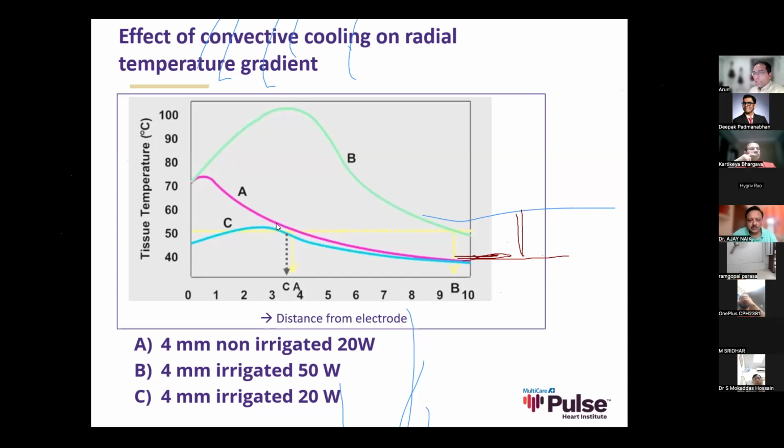Okay, sure. So half normal saline becomes important for deeper lesions because the ion content in half normal saline is much lower, and that leads to less dissipation of energy into the surrounding environment. If you are irrigating with a lot of ions in it, it will lead to more conduction through the environment, and less energy will actually go into the tissue with a normal saline.